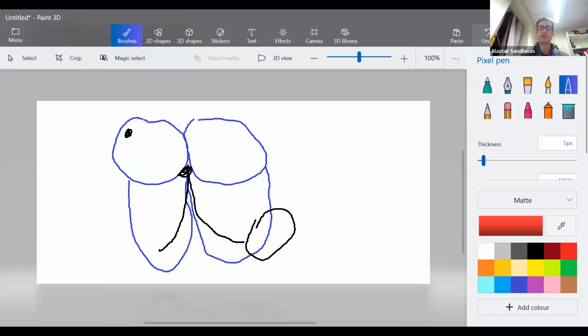So the scar is imperfect. If you look at the muscle, the scar is imperfect. It has little channels in it, actually. So let me try and draw it properly to explain things. So it's not a perfect scar, and this is why we get ventricular tachycardia. So the depolarization comes here, it goes into the scar, comes out of the scar, okay? So this is a patient that will have a broad complex rhythm, and you'll see that on the ECG. It will not be a typical bundle branch block pattern. So how can we tell it's VT?